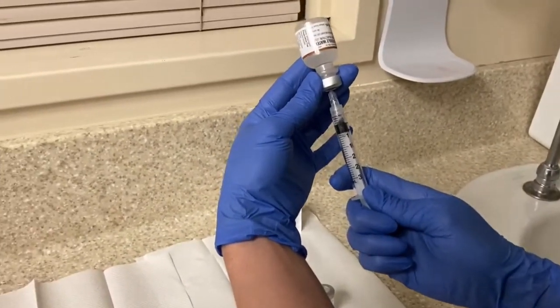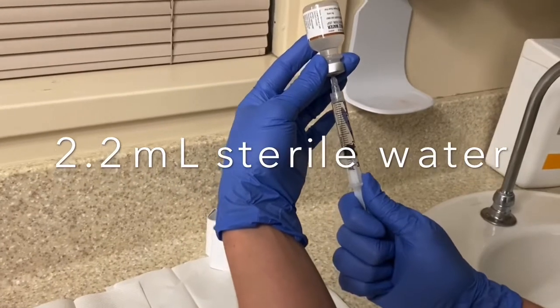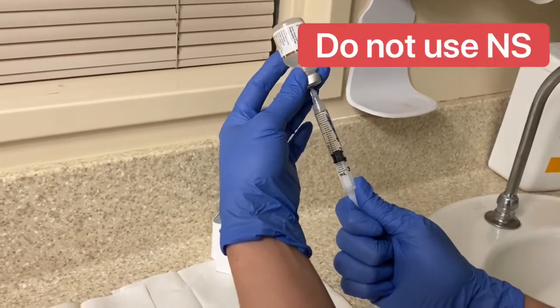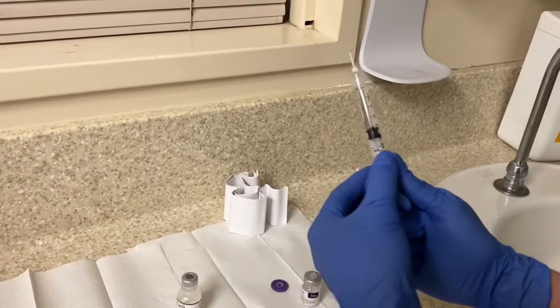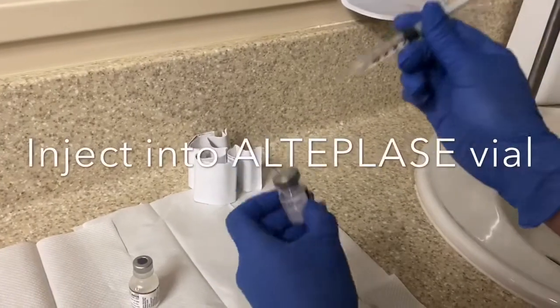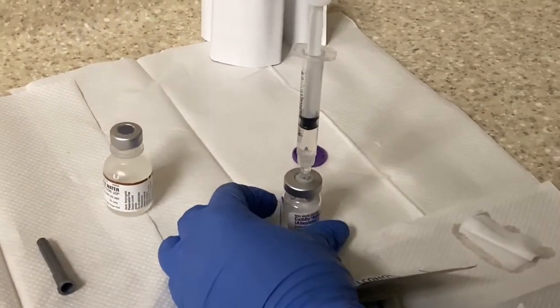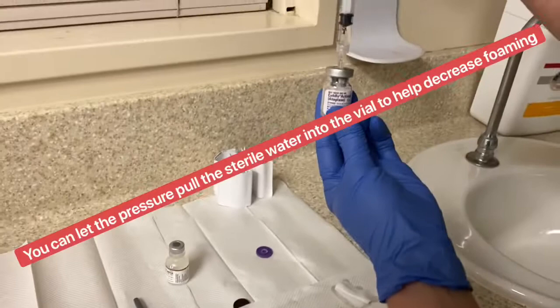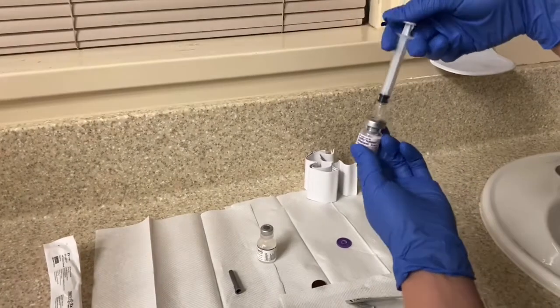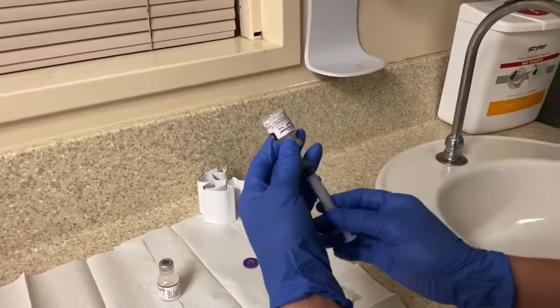I'm grabbing 2.2 ml of sterile water. Slowly draw it up — make sure you don't use NS. Then you're going to go ahead and insert this into the alteplase vial, using sterile water and not NS. As it's drawing in it creates kind of a vacuum, so you don't have to push it in too hard because otherwise it's going to foam — just gently push it in there.